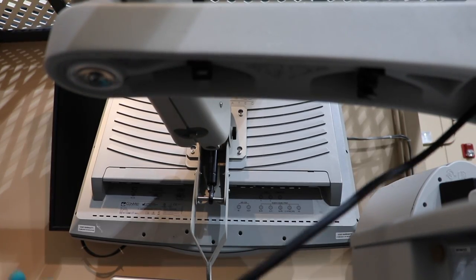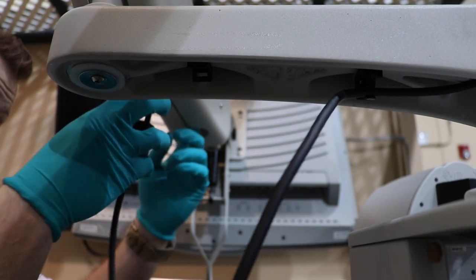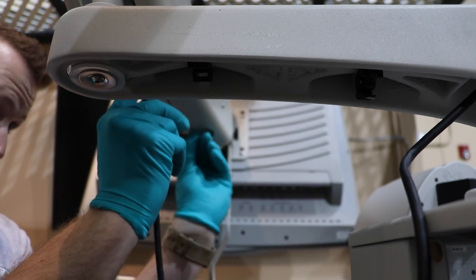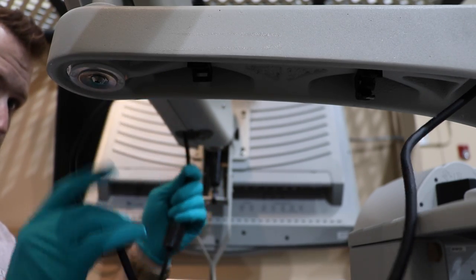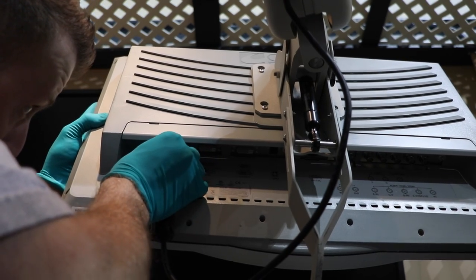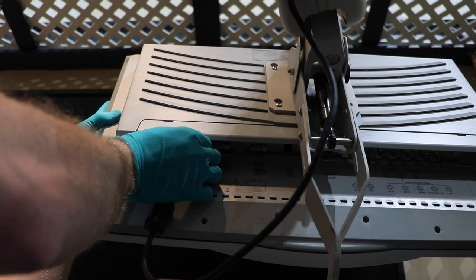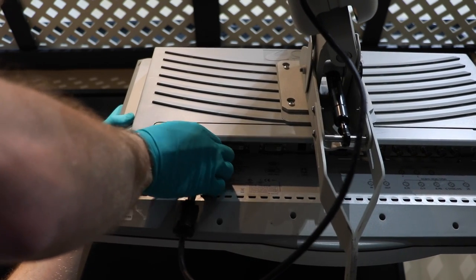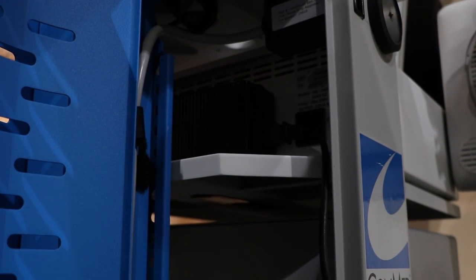Let's go ahead and feed it through the arm and plug it into the back of the monitor. Now let's go ahead and take the power supply for the DRS02 and plug that in.